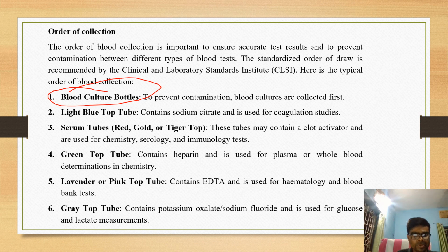And now come to the second, the light blue top tube. That means I am talking about the sodium citrate, that means the blue vial.